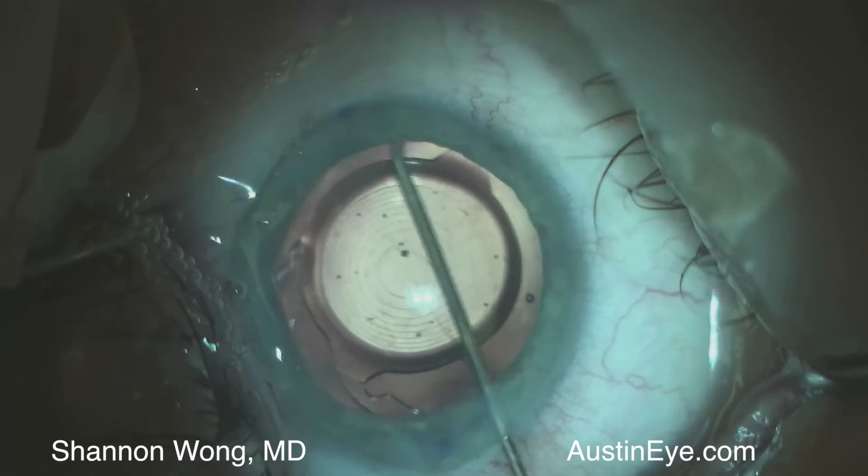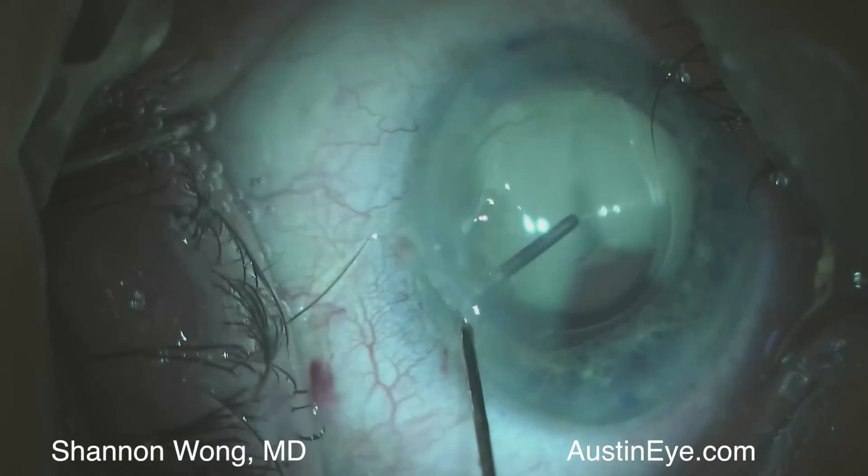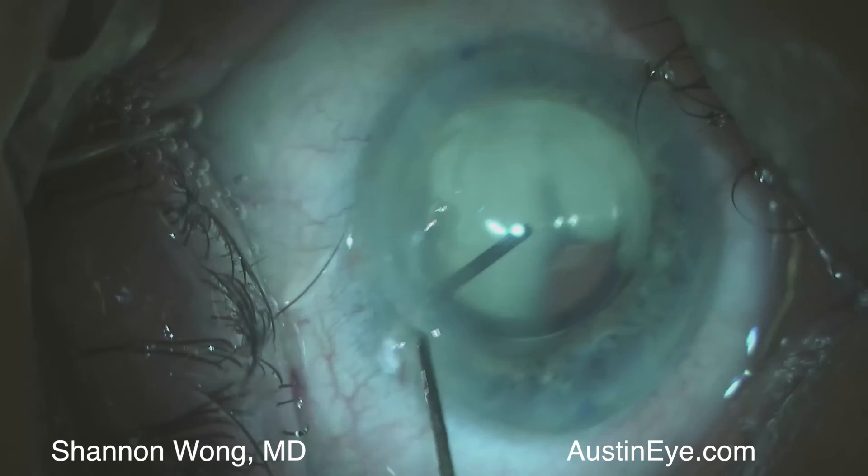This patient did beautifully. The lens centered perfectly and she saw 20-20 the next day without glasses. Thank you for your time and attention.